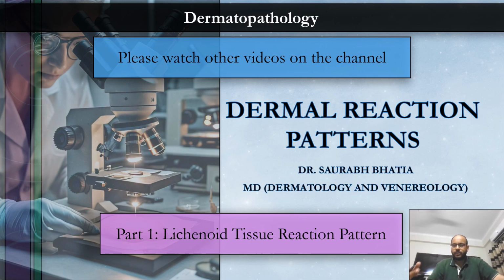Okay. For a dermatologist, every slide is a clinico-pathological correlation. You need to correlate the findings that you see with your eyes to the findings that we see under a microscope. And when you're able to bring both of these together, the pathological features and the clinical features, you're able to make a better diagnosis. Sometimes you may change your diagnosis depending on pathology findings, or sometimes you try to explain the pathology findings as per the clinical morphology. But most of the time, it's easier for a dermatologist to understand the slides, understand the pathology, when they have a good understanding of the pathomechanism.